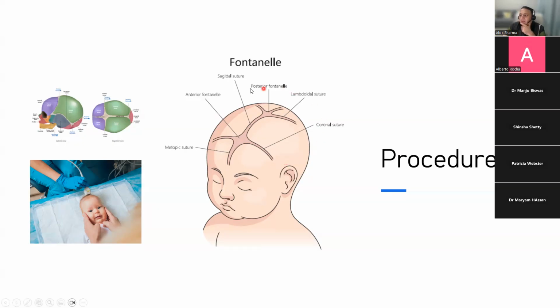But amalgamation of all of these views then basically results in what we call an enhanced scan. An enhanced scan is quite detailed, quite long, and is not necessary for every baby. So the procedure itself really depends on the clinical indication and depends on what local protocols you have developed.